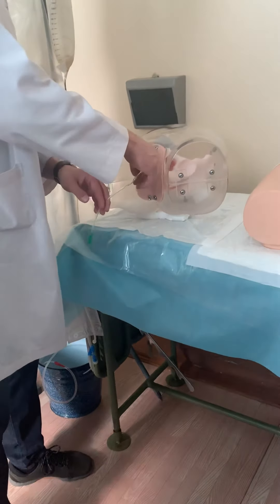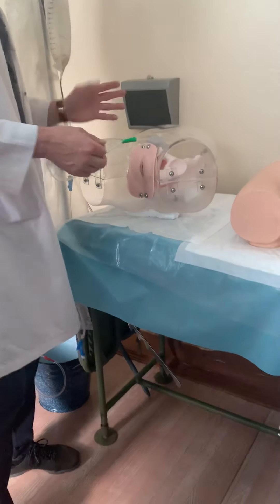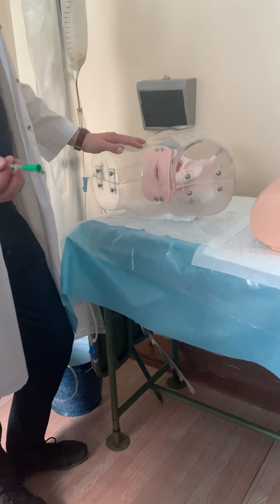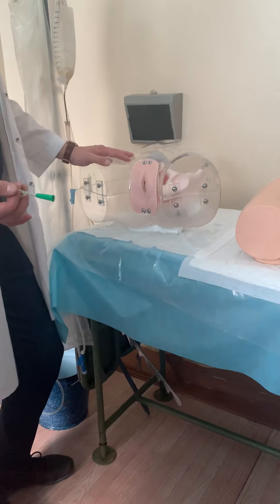When urine comes out, you stop the procedure, remove the urine, and remove the catheter. Do you have any questions about this procedure?